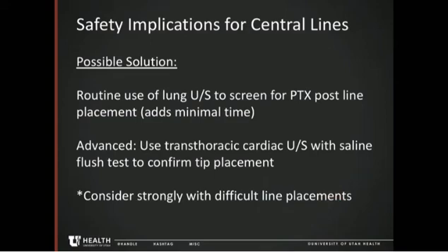Certainly, if these practices are not universal at your institution, you could consider using them in all cases. Or if you're just starting to add this to your practice, you could consider doing them after difficult line placements, especially when you're supervising inexperienced residents and wanting to give yourself that extra peace of mind that you're proceeding through the case with a line that's in the right spot and you don't have a pneumothorax slowly growing.